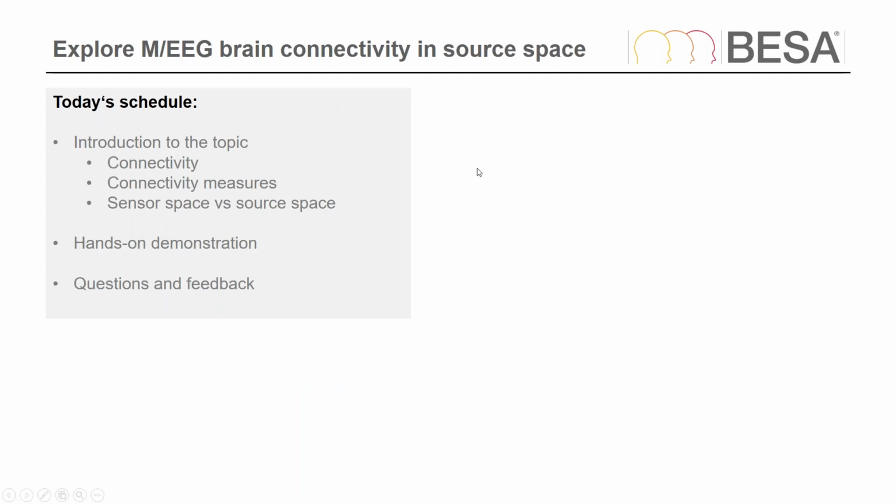So today's schedule is, first of all, I will give you a short introduction to the theory behind analyzing EEG or MEG brain connectivity. Then I would like to demonstrate some effects hands-on using the BESA connectivity software. Altogether, I expect this to keep us busy for around 45 minutes.